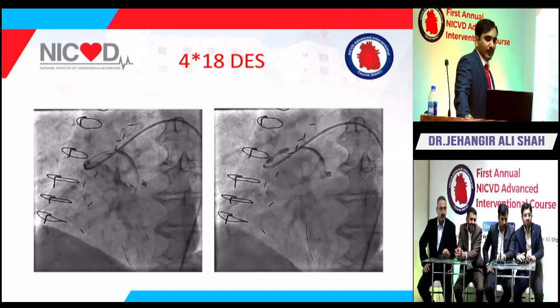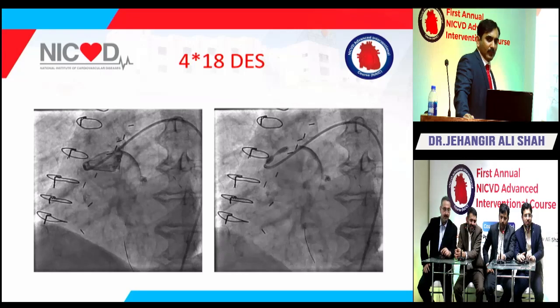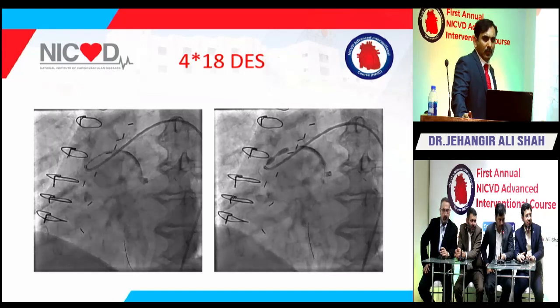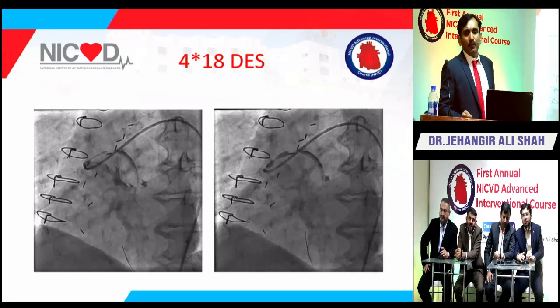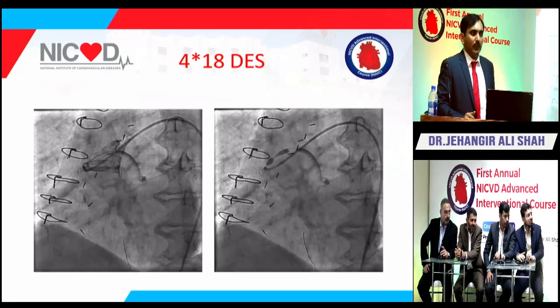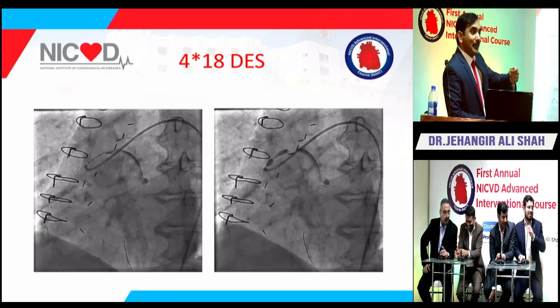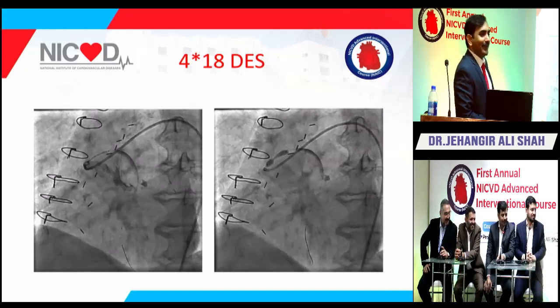If you are not sure about the angulations and projections of the ostium, then we can take another wire for the landmark. That can help us. It's quite difficult because your guider is in an unstable position. How can you confirm that your wire is just covering the ostium? So why are you complicating the case? There's the option to take another guider, give an injection with it, and fix the ostium.